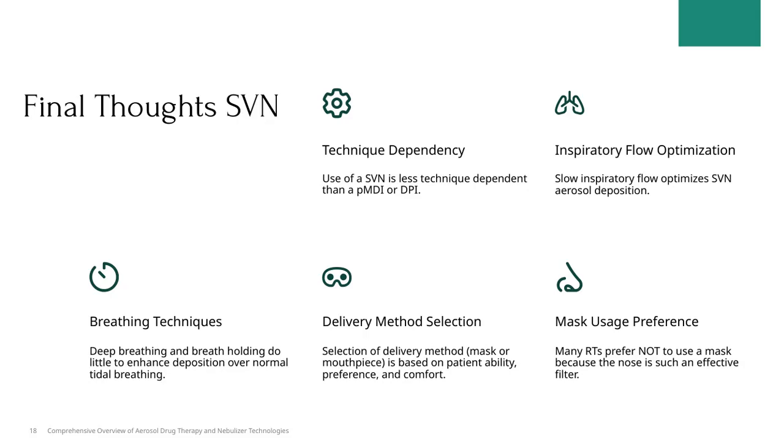Many respiratory therapists prefer not to use a mask because the nose is such an effective filter. This means that when possible, using a mouthpiece can sometimes be more comfortable and efficient for the patient. The choice between a mask or a mouthpiece really depends on the patient's ability, their personal preference, and what feels most comfortable for them. Now, when it comes to breathing techniques, it's interesting to note that deep breathing and breath holding don't significantly improve drug deposition compared to normal tidal breathing.